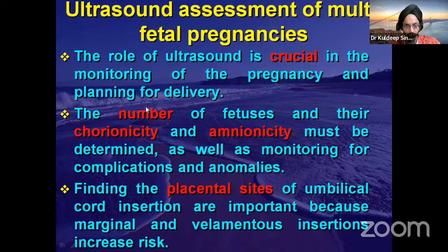We're going to start it off. Then there's a question from Dr. Madhu. Yes, Madhu. How do you measure AFI in twins?